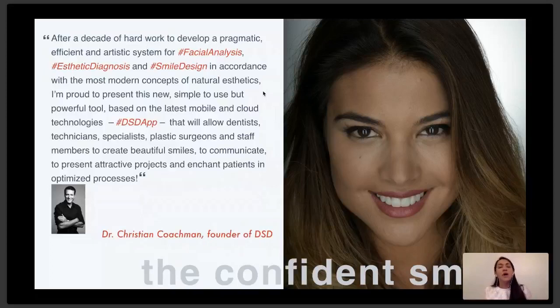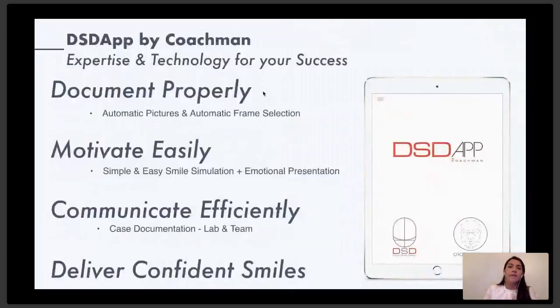Okay, so once we design the smile and once we try it in the patient's mouth, we want to see that they feel comfortable with that smile. Not necessarily has to be perfect in our eyes. The DSD concept and everything is to give back the confidence to your patients, the confidence in their smile, with a smile simulation and then a digital smile design.